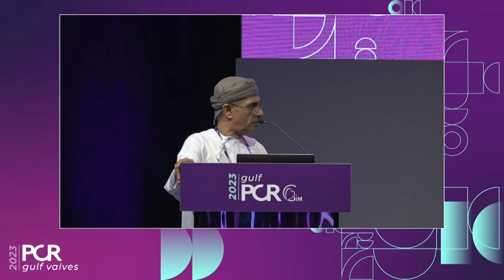Both valves, the Accurate and Navitor, are great valves for future valve-in-valve. But the Accurate, the problem is it's not retrievable. This one is repositionable, retrievable, recapturable fully. True, it's the same as the balloon expandable. There's a way to deploy it. If you deploy it in the right way, it shouldn't be an issue.